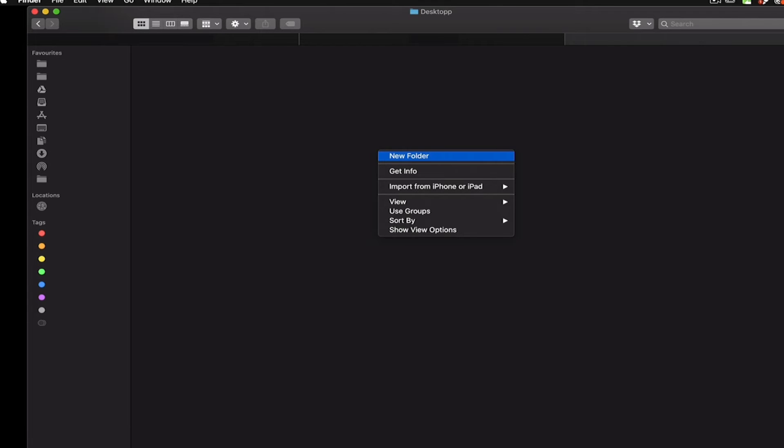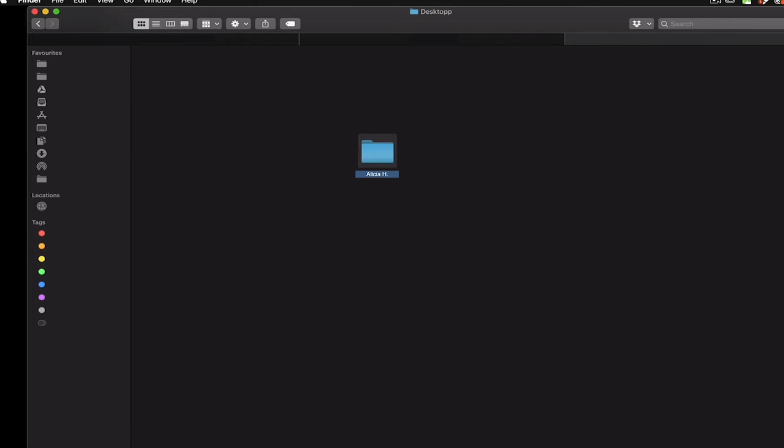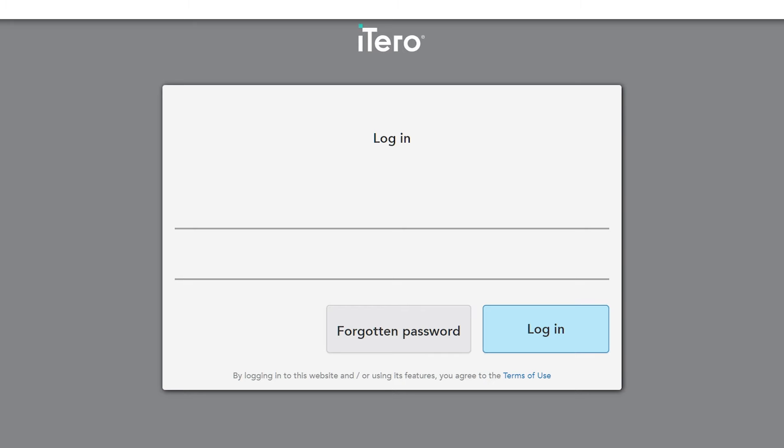Create an export folder on your local system using a unique patient identifier code, depending on your clinic's operating procedures. Log in to myitero.com.